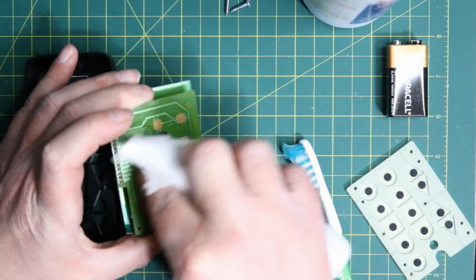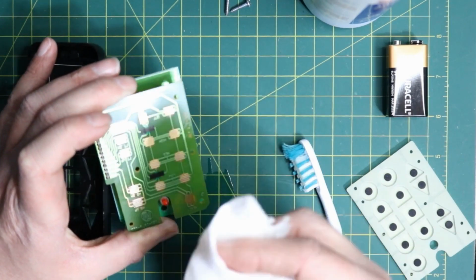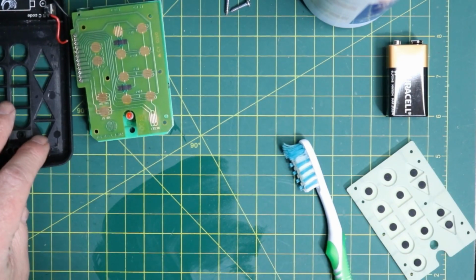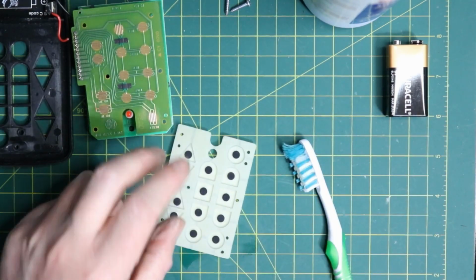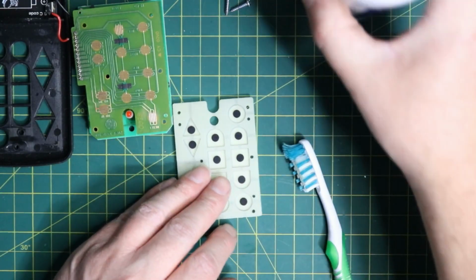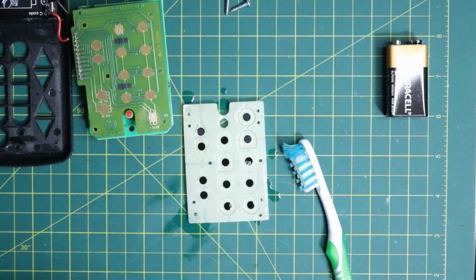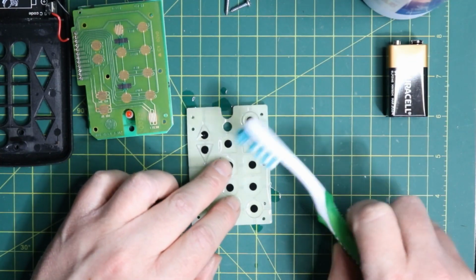Nah, it's not too bad. Looks pretty good there. So we'll just double check, dry it up, and then we'll get this inlay all cleaned up. We'll use the toothbrush on it again and get that all cleaned up there. And with this, I'm not worried about usage, so we'll just fill her up there.